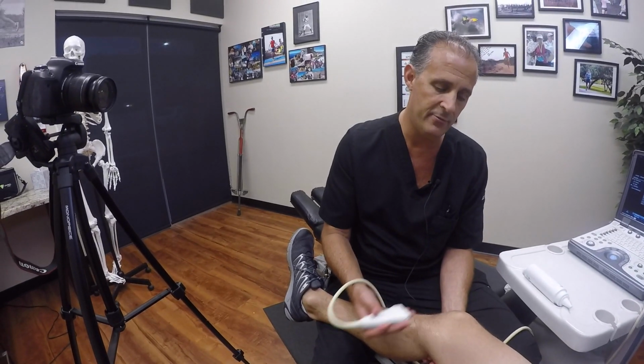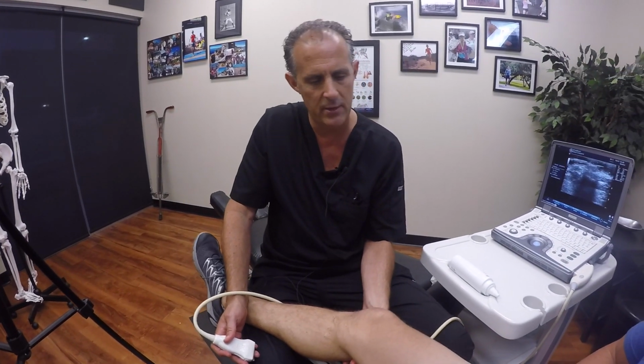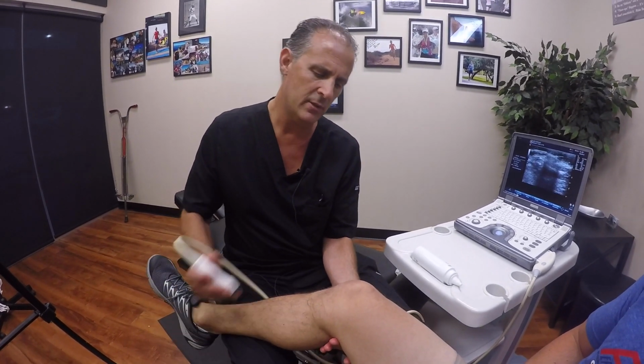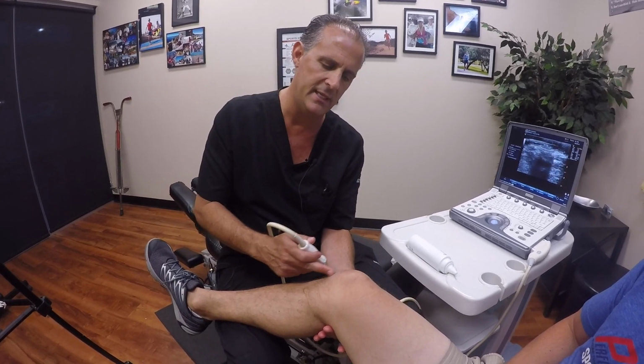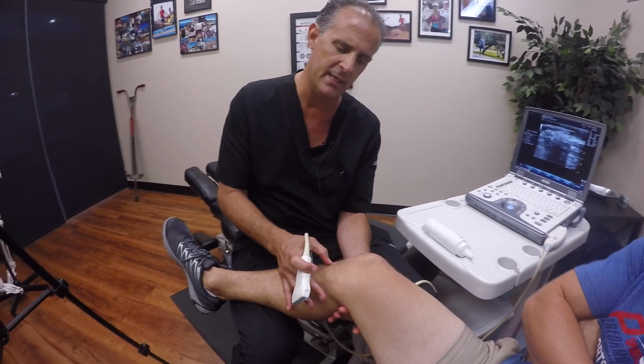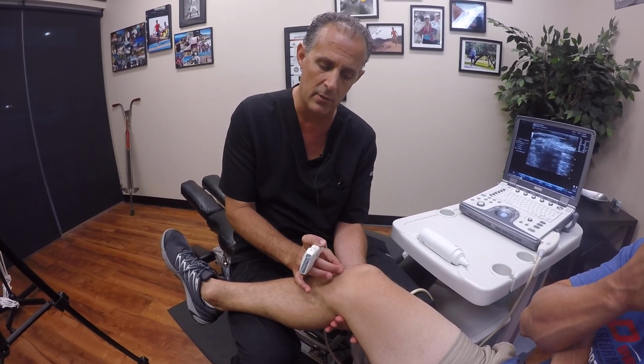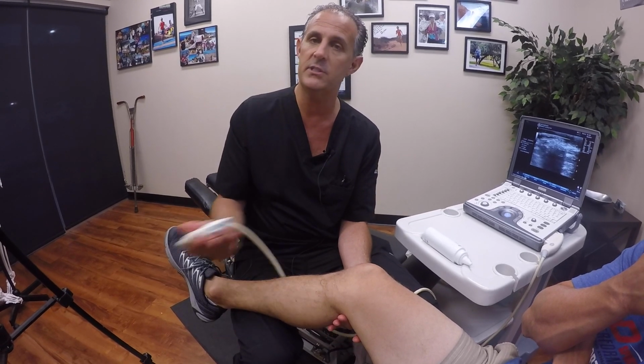Ultrasound's advantage by far is the dynamic assessment of the knee, whereas in MRI you're lying there in a completely still position. Ultrasound allows you to bend, to put a little stress. So let's say, for example, our next stop with the knee is the patella tendon, and the suspicion is that there might be tendinitis, but maybe there's a tear. Maybe there's a small, moderate, or large size tear, and you're just not sure.